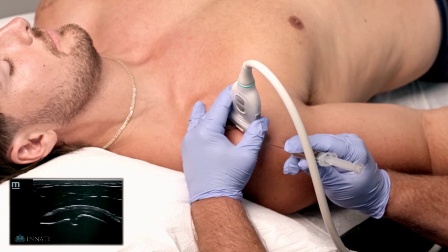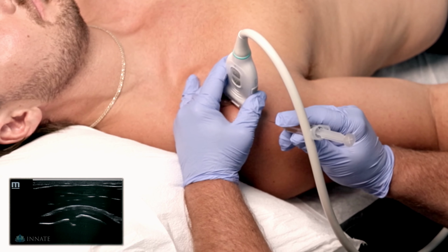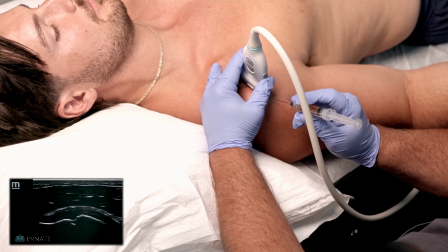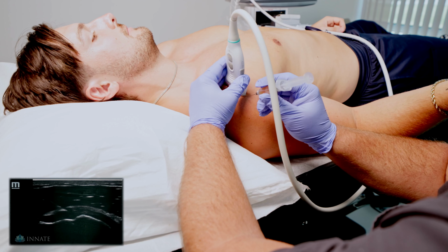I'm gonna slowly advance the needle. Right there, we get to the rotator cuff.